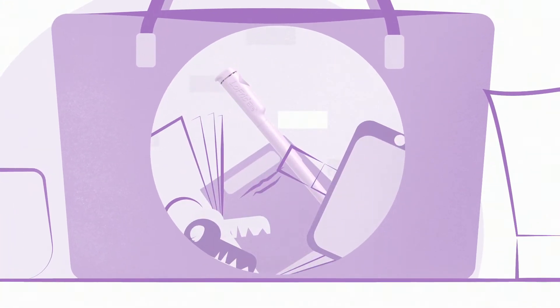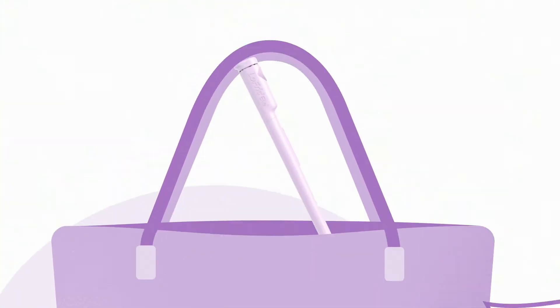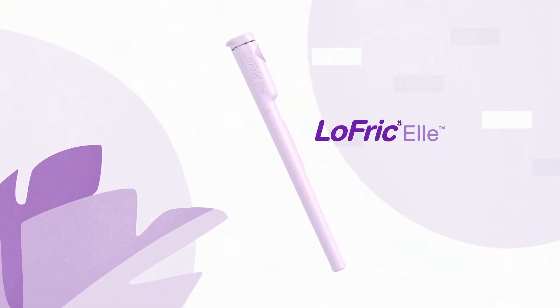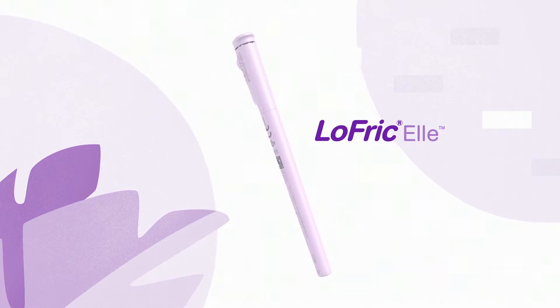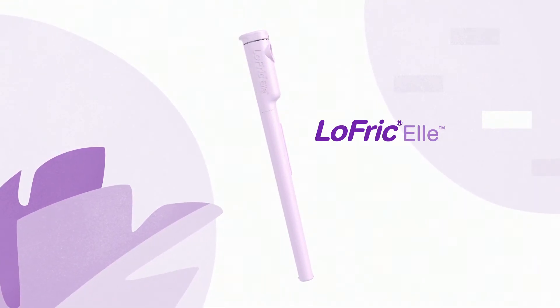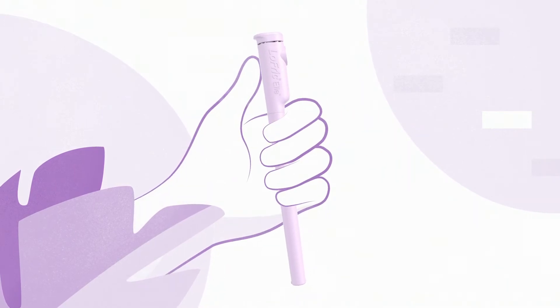When it comes to practicing self-catheterization designed to support you and your lifestyle needs, say hello to LoFric Elle — a single-use urinary catheter ready to use, designed together with women practicing self-catheterization and healthcare professionals. Here's a step-by-step on how to use it.